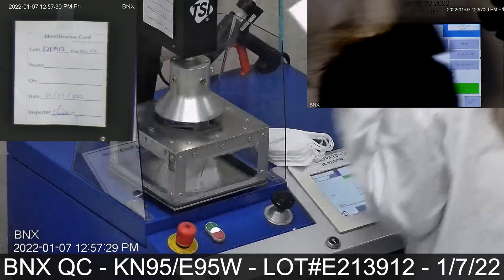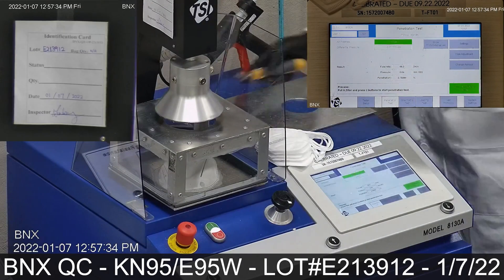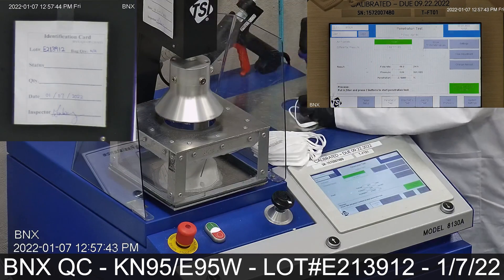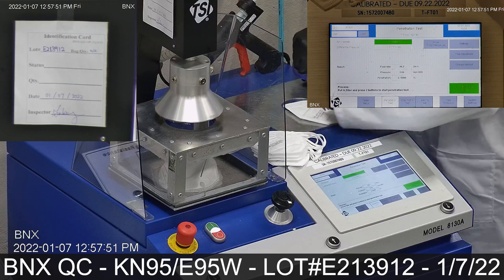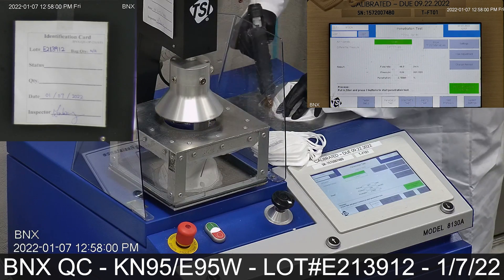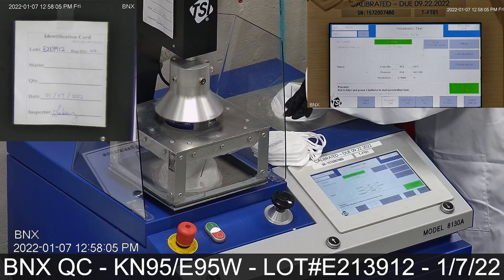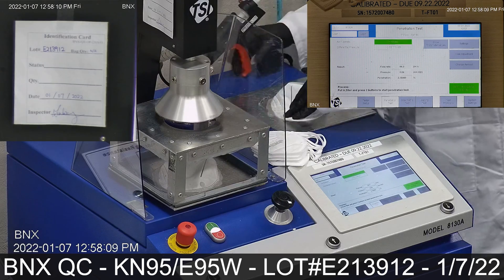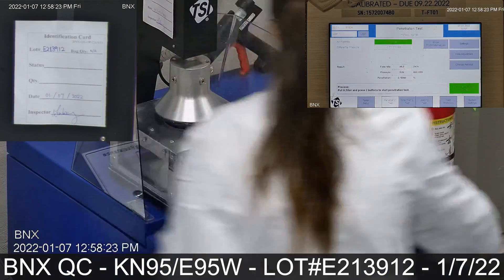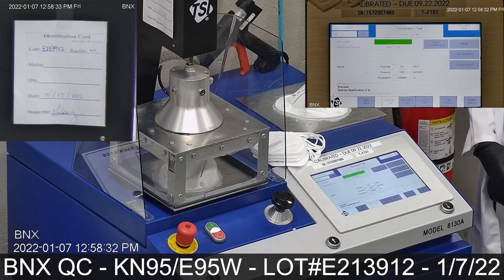TSI visits our facility annually and conducts field service for the 8130A tester for calibration purposes. Additionally, we conduct testing on a regular basis by using TSI green line papers to make sure the TSI 8130A filter tester is giving accurate results.